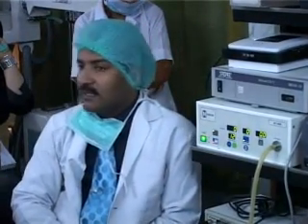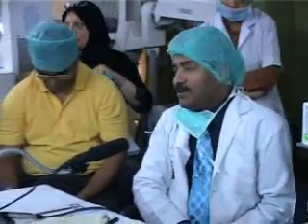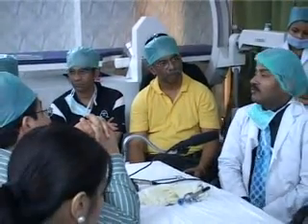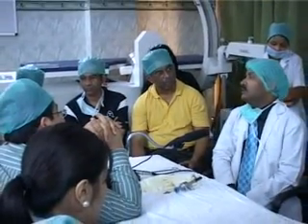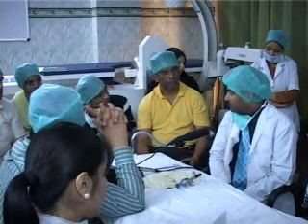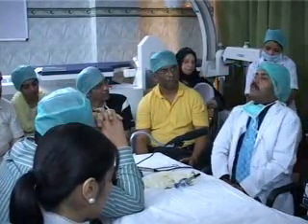It is necessary. Is the preset pressure the same for hysteroscopy also? No, the preset pressure for hysteroscopy is 150 to 180 millimeters of mercury. That is with fluid. I will discuss that later separately. Regarding CO2, there are so many types of CO2. CO2 has very many problems.